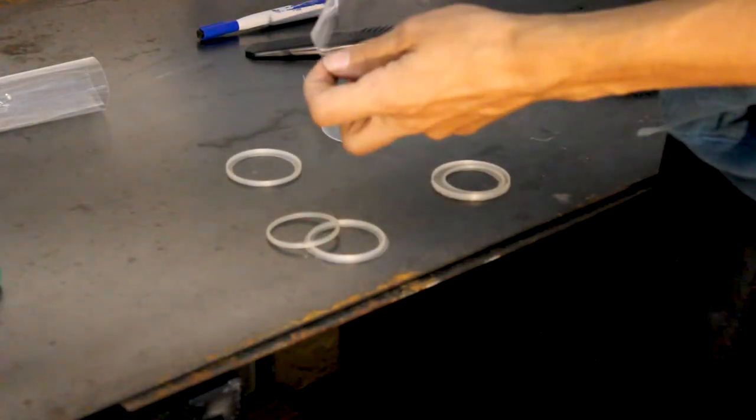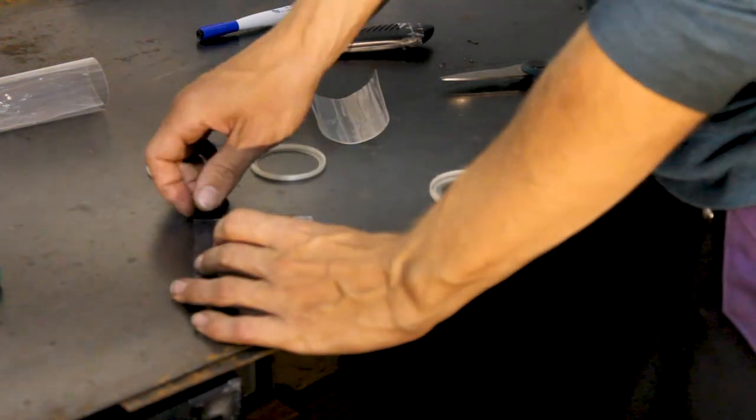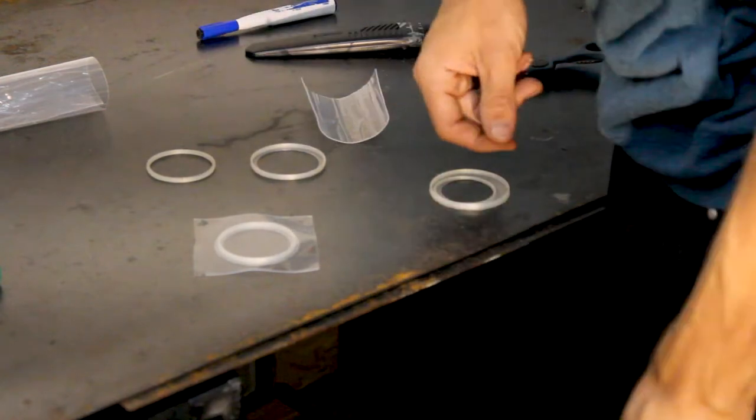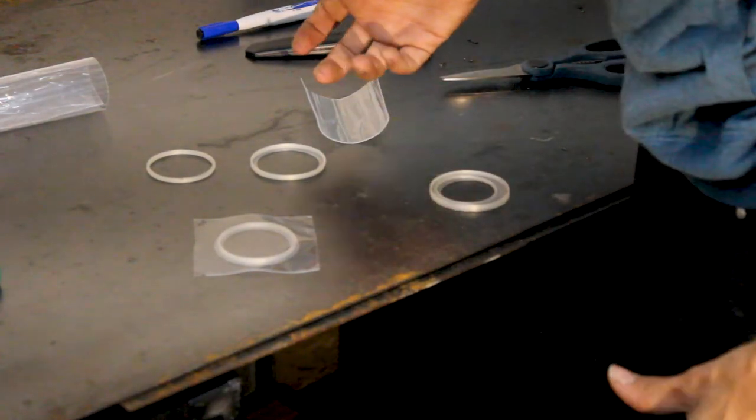Yeah, I maybe cut that one a little too big, but that's good. I think ideally I would have this stretched out, maybe by a partner or by some clamps. Yeah, in fact, I'm gonna do that.